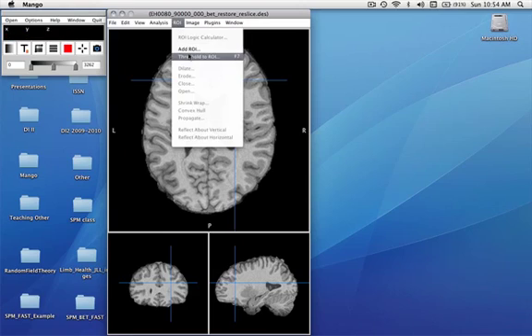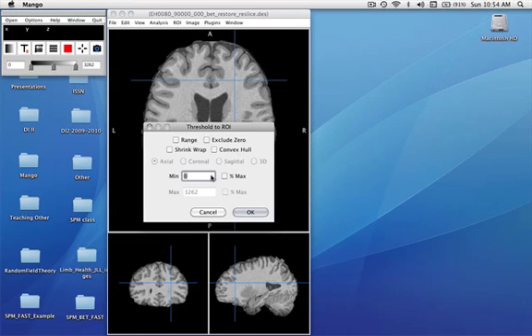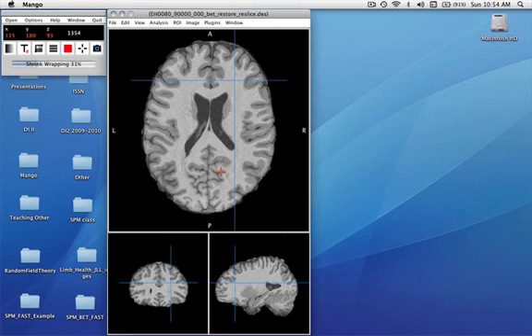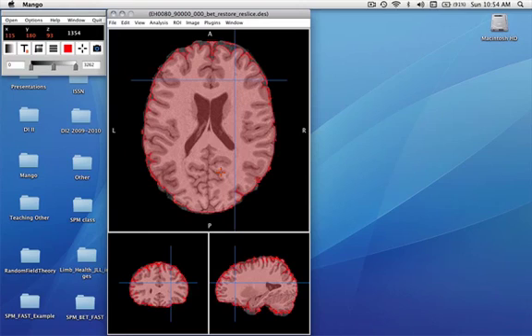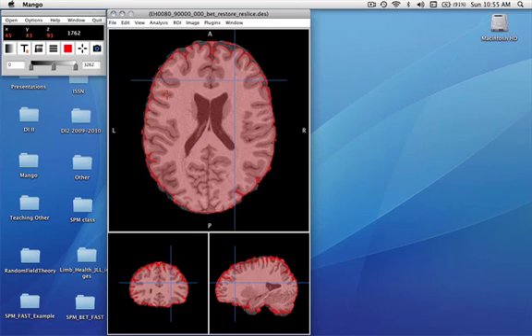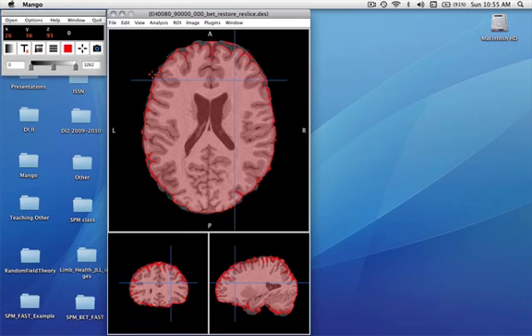Let's use a slightly different approach. We'll use shrink wrap and we'll go to the 25% max and see what we get. Now we've excluded some of these things on the interior, because the shrink wrap wouldn't go inside yet. But we do need a slightly different threshold to exclude some of the superficial features.